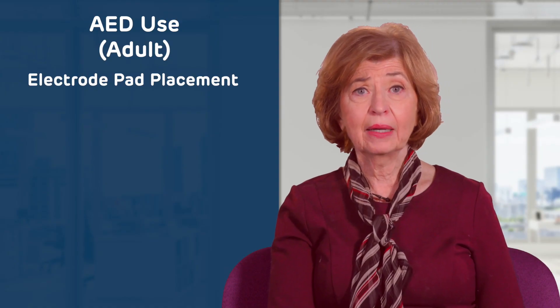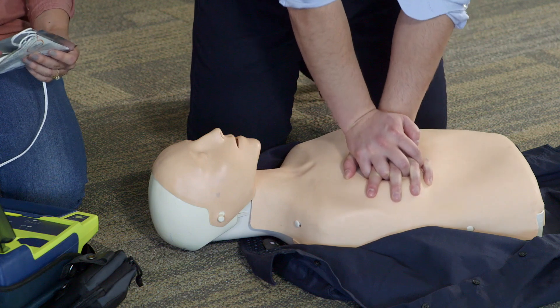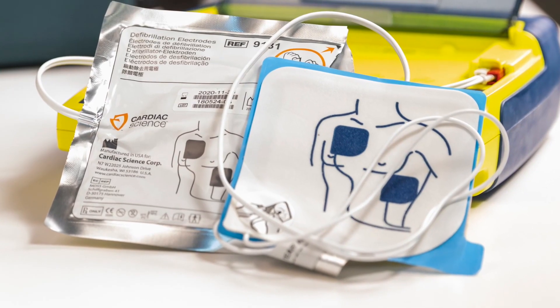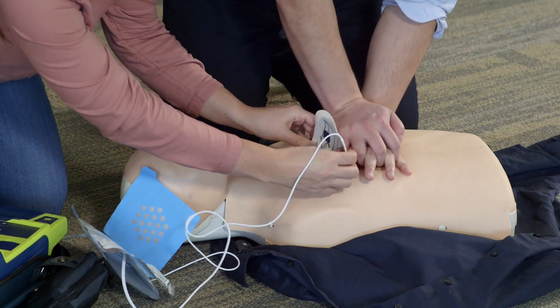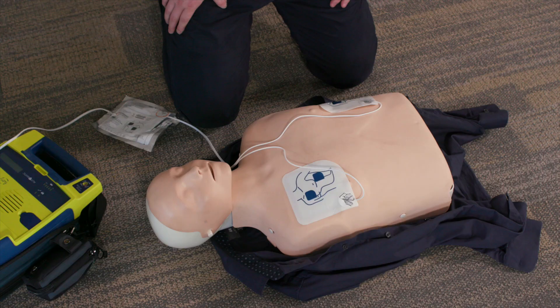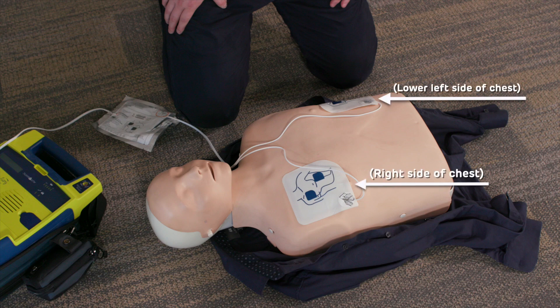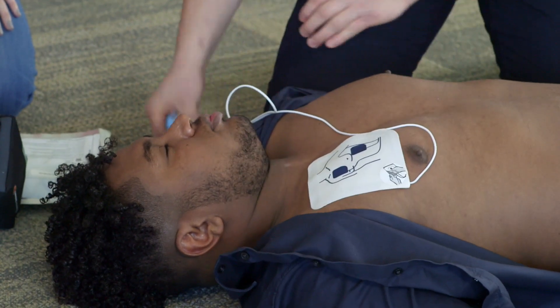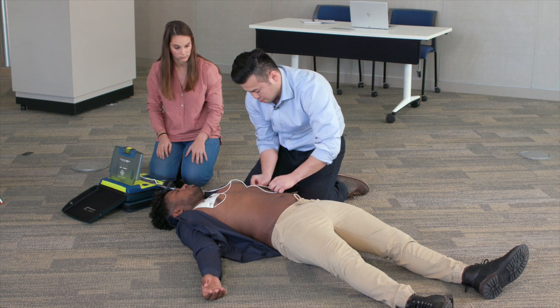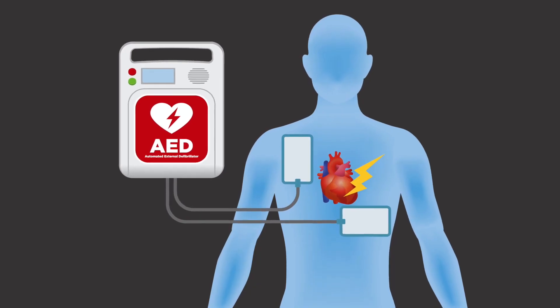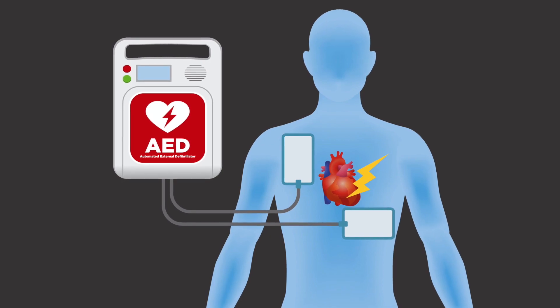Electrode Pad Placement: Open the electrode pads and place them on the victim's bare chest as shown on the pad pictures. One over the victim's right chest just below the collarbone, and the other on the left side of the victim's chest below the left nipple. Place one pad on bare upper chest, and peel the second pad and place on bare lower chest as shown. The position allows the shock to discharge across the heart.